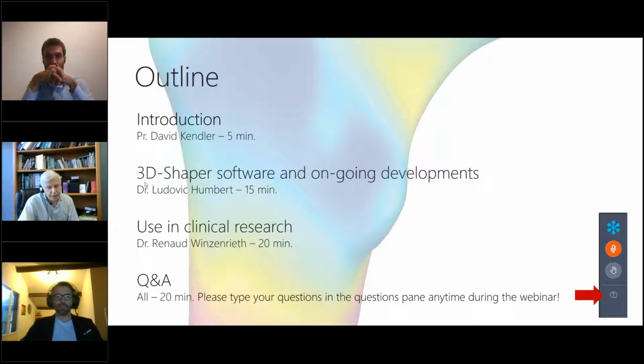We also know from a variety of studies that the distribution of bone density in the proximal femur may have great import in predicting fracture and in predicting anti-fracture efficacy of different therapies, because the different therapies we have may affect cortical and trabecular bone compartments in a different manner, and therapies that have a greater cortical bone effect may have greater efficacy in preventing non-vertebral fractures.